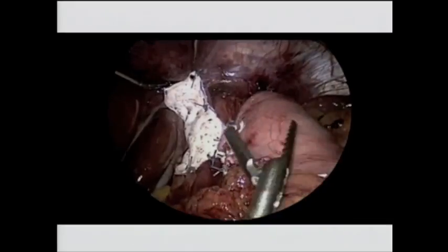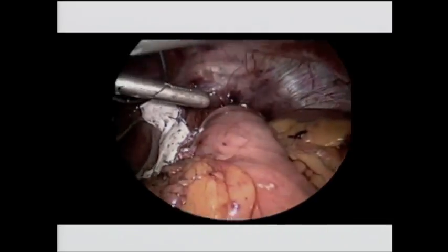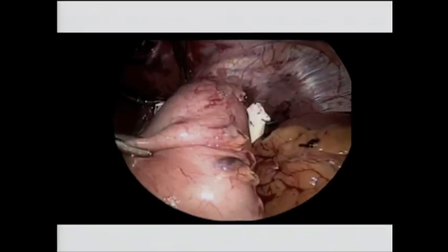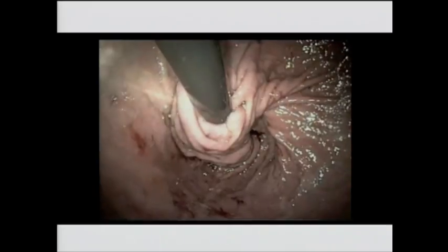This is actually the video from Top 21. This was created before we had high def in the OR. It's lower def, but that's the exact same operation that Michelle just created 2 years later. Short gastric, 180 degrees opposite the fundoplication in the front. And you'll see the endoscopy here at the end. It's going to look just like the one Michelle made. And to me, that's really the benefit of this whole thing.